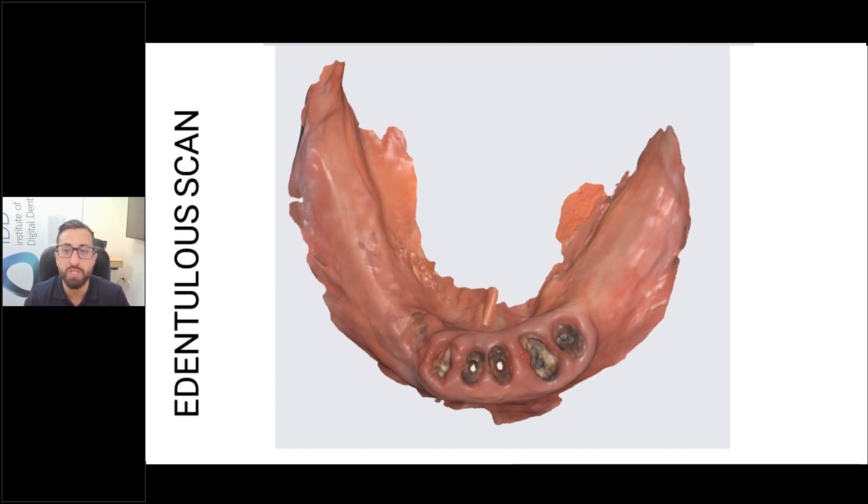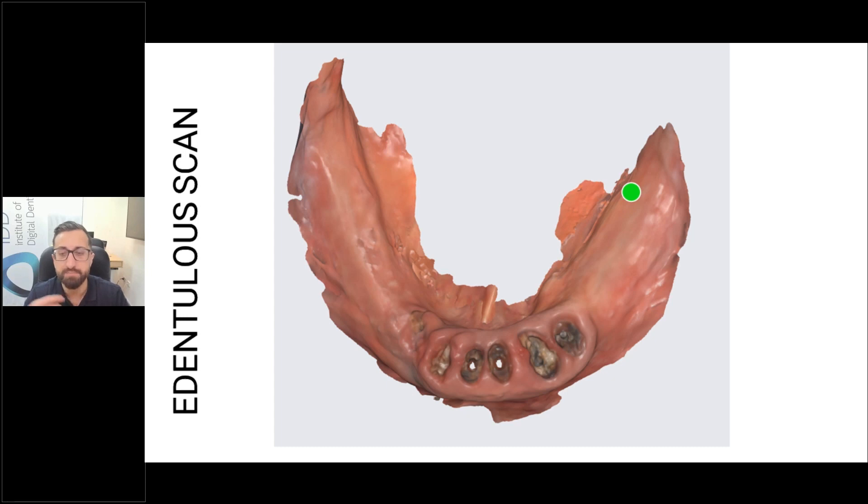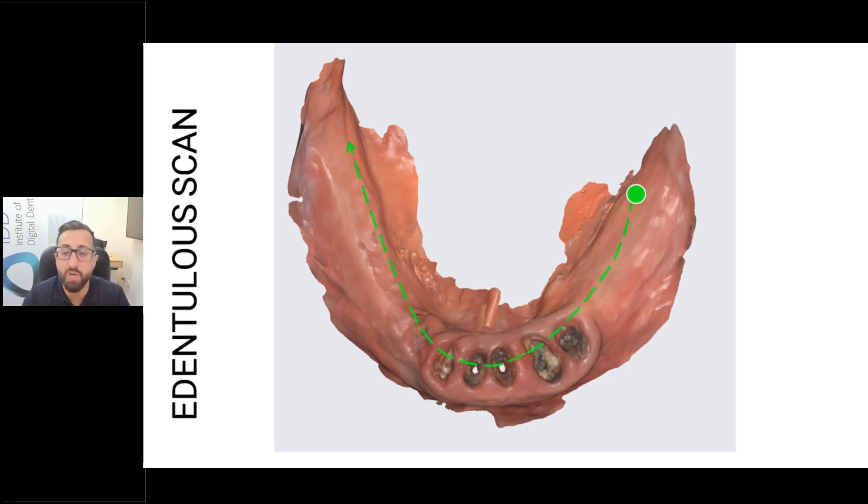When you start on the lower arch, begin at the retromolar pad and treat it like your normal full arch scan. Go around the arch and across, then rotate and scan the buccal. Oftentimes these ridges are so resorbed that you can scan the buccal and the occlusal in one pass — you don't need separate occlusal, buccal, and lingual passes. Often after just two passes you've scanned the whole ridge, because it's so resorbed.